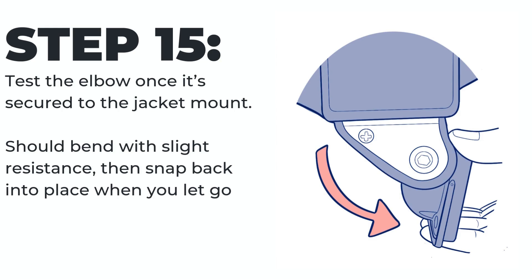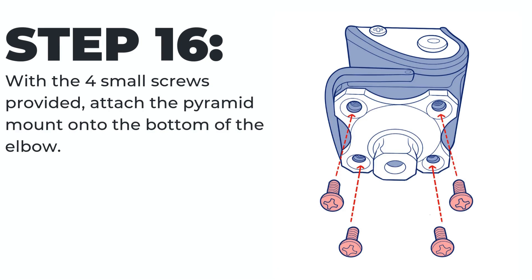Step fifteen: test the elbow once it's secured to the jacket mount. It should bend with a slight resistance, then snap back into place when you let go. Step sixteen: with the four small screws provided, attach the pyramid mount onto the bottom of the elbow.